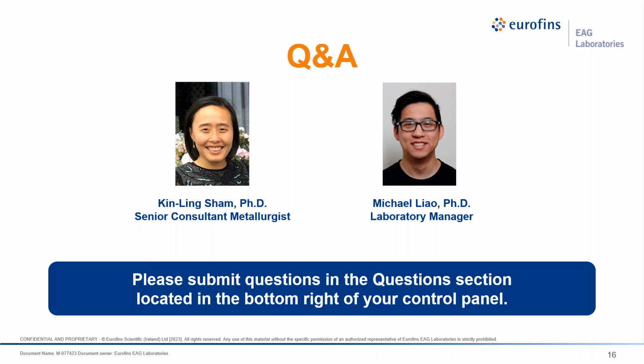And if it's not implantable, and it doesn't have to sit in your body for a long duration of time, then the question is, do we need the ASTM F2129 test, or can we do another test if it is something that is reusable or only in the body for a short period of time?